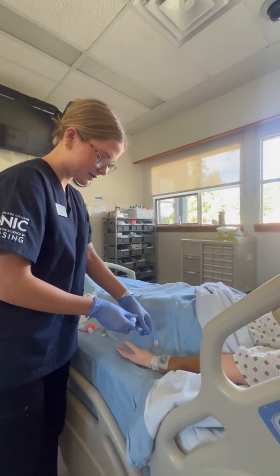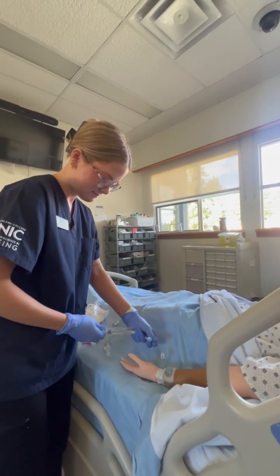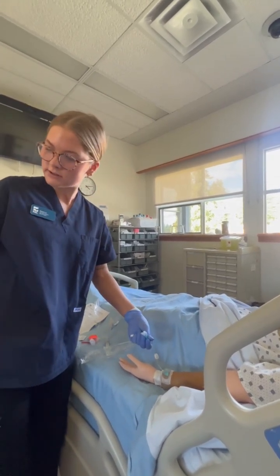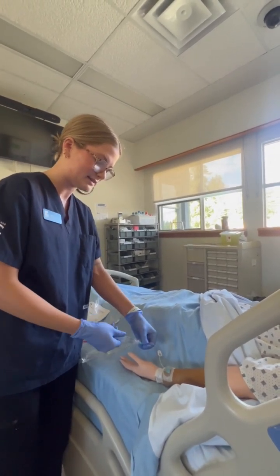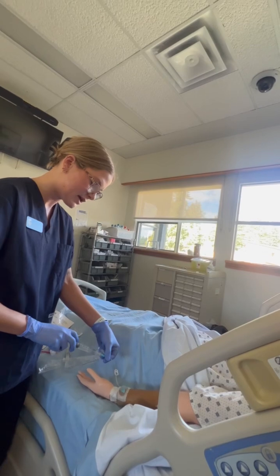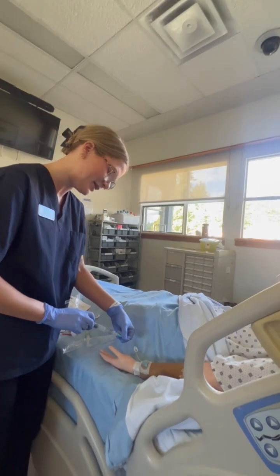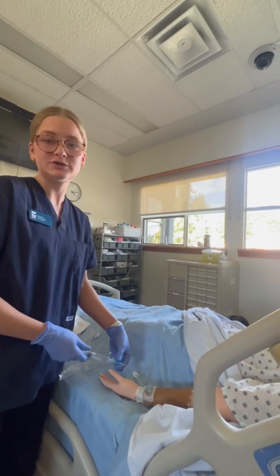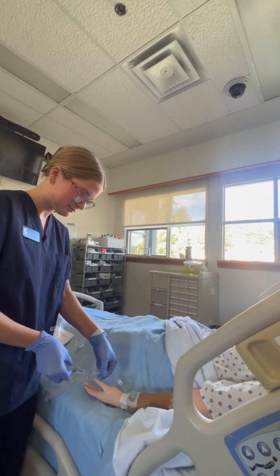I'm going to get another IV flush. If I can open it. All right. I'm going to let the air out. And for this, I am going to administer this normal saline at the exact same rate that I administered the medication. So this would be 2 milliliters over 1 minute. Again, for time sensitivity, I am not going to do it for an entire minute. But that is how I would do that, ensuring that there's patency. And then I would do a little bit more and use the push pause effect to clamp.